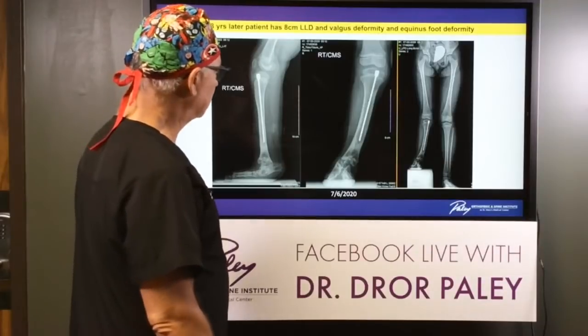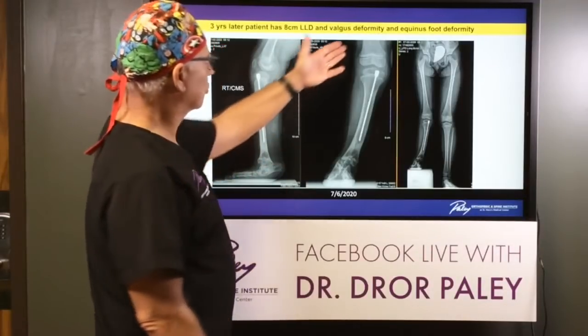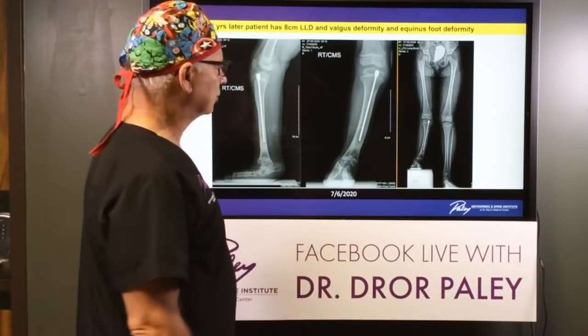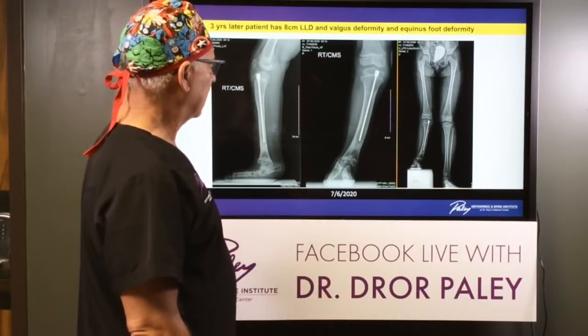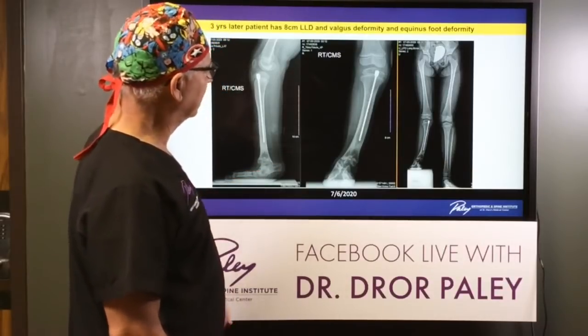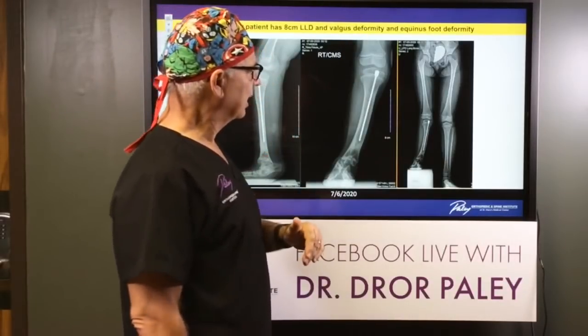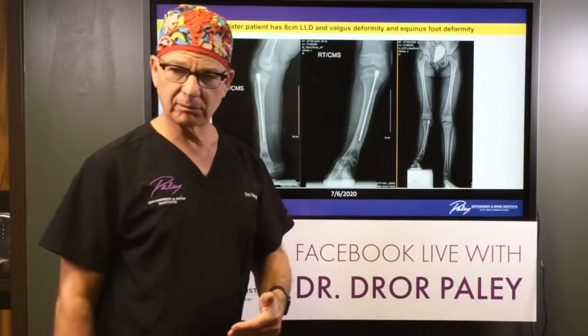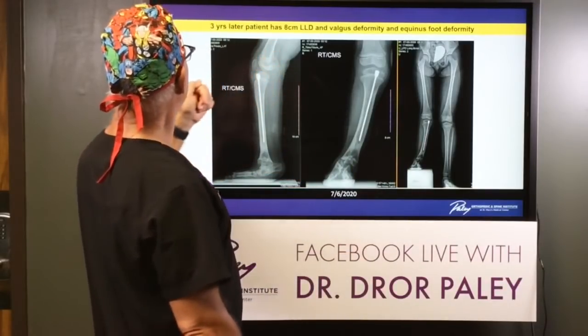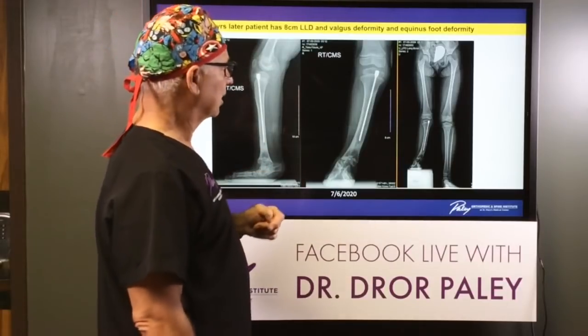And here she is. She's still under treatment right now because remember, this was September 10th. She was the first patient treated this way. And she has lengthened, I think, about 3 centimeters so far. Look at the beautiful bone forming. In fact, bone forms better with the plate than with the nail, because the nail goes in the middle of the bone, just taking up some of that space where you'd have that new bone. And so this is really exciting.